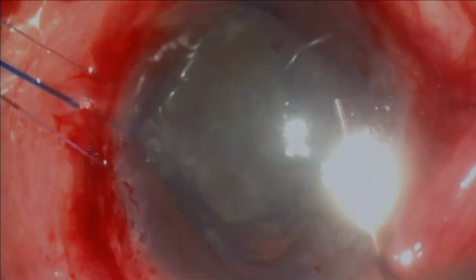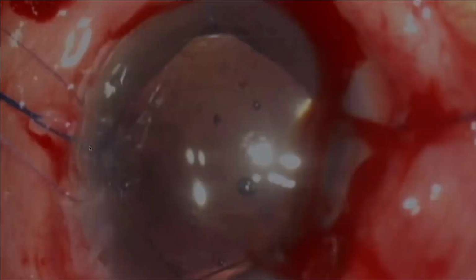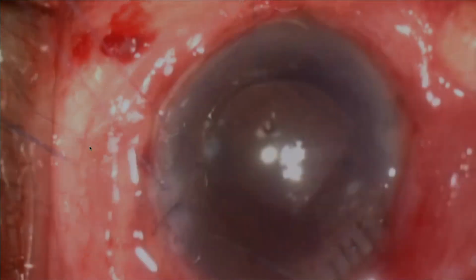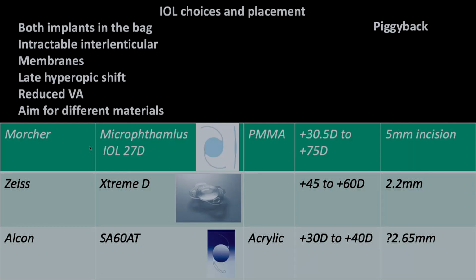Once this is done, you can start off with your phaco. Fortunately, the lens is not very dense in this particular case, and the phaco goes well. I'm using the IA to get rid of the last pieces here. When you put the lens in, you have to have a look at the back of the eye. Are there uveal effusions occurring? And this is where I do the BIO. And I put in lots of sutures into the incision here to stop any future shallowing and malignant glaucoma occurring.